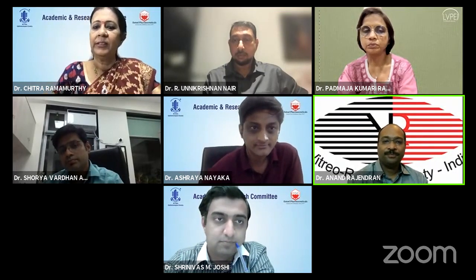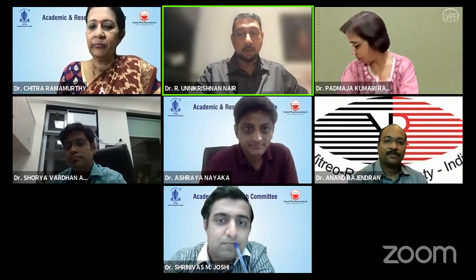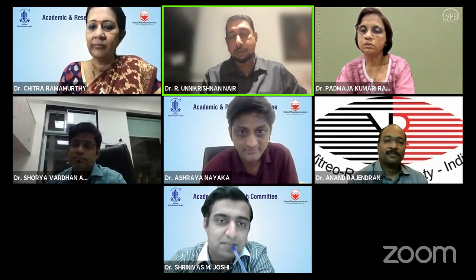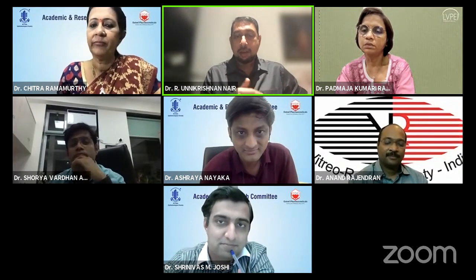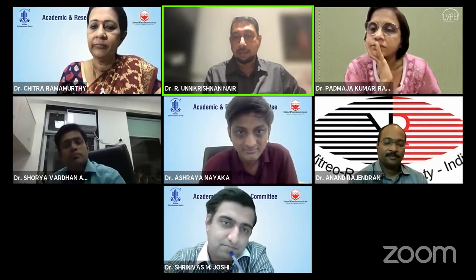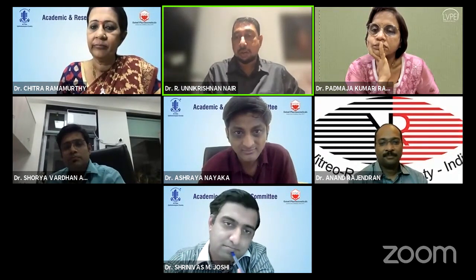Yes. Last comments from Uni sir, please. Basically, it was a great talk. I just want to make a small stress, a small thing for the general ophthalmologist. The term that is introduced, CRORA, is the umbrella term. Geographic atrophy is a subset of CRORA. You can define CRORA in the presence of elevations of the RPE, that is PED and CNV. Geographic atrophy is when the RPE is flat. So it's a subset of CRORA.